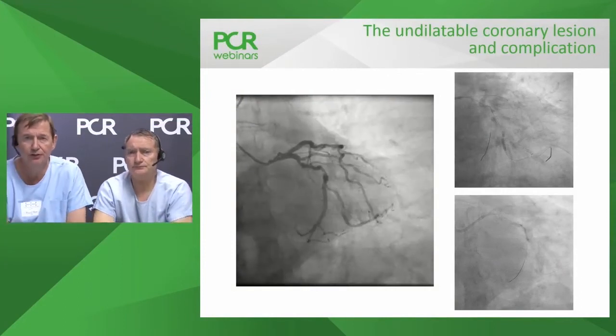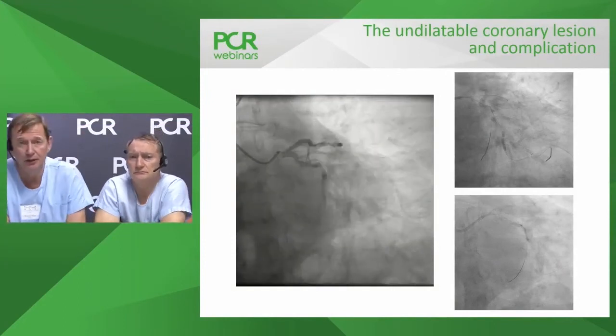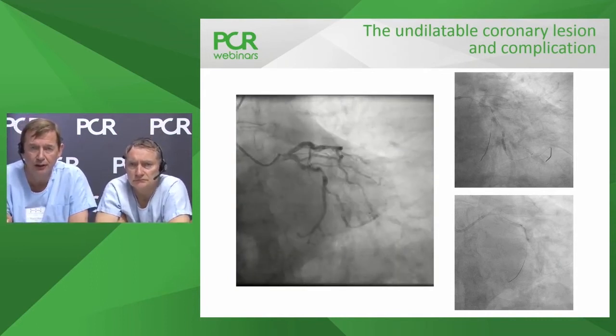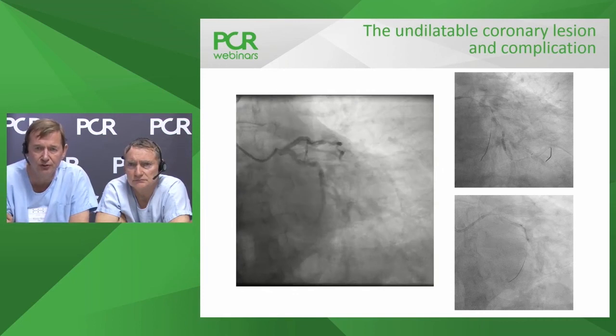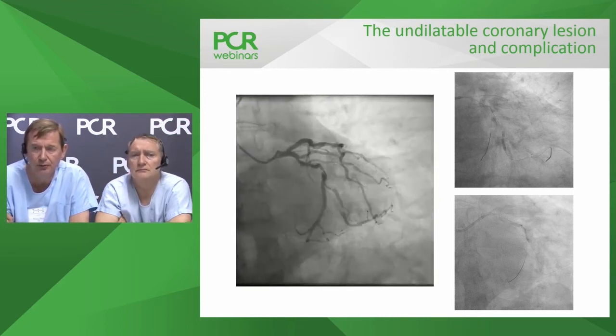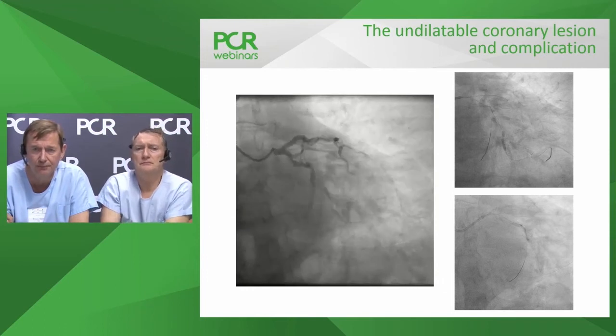Okay, this is a case done, in fact, by the unit in Toulouse here, and it was transferred in the last couple of weeks or so, where you can see the angiogram of a very tortuous calcified ostial obtuse marginal, which was treated with balloon therapy. And in fact, you can see some of the intervention on the right-hand slide.